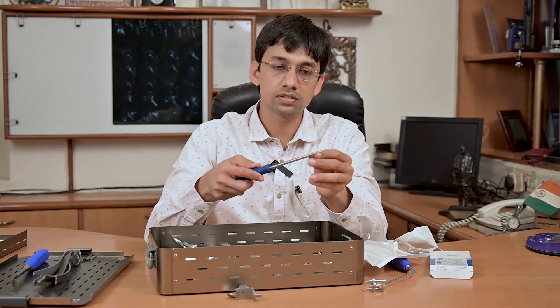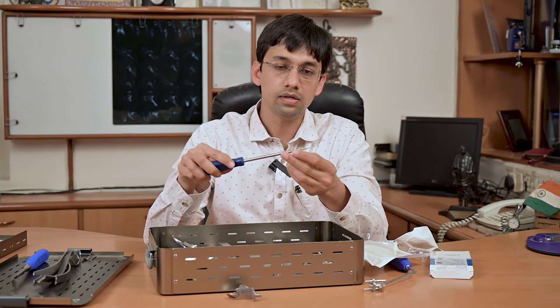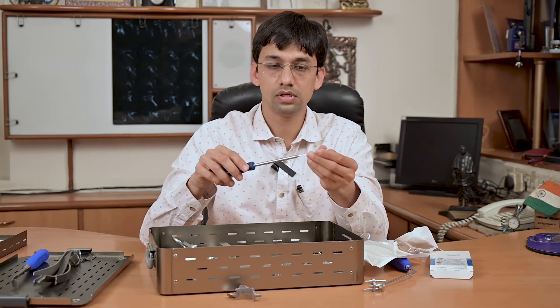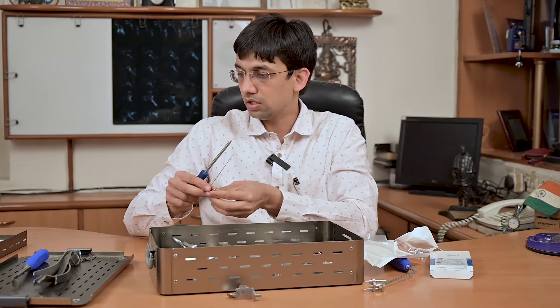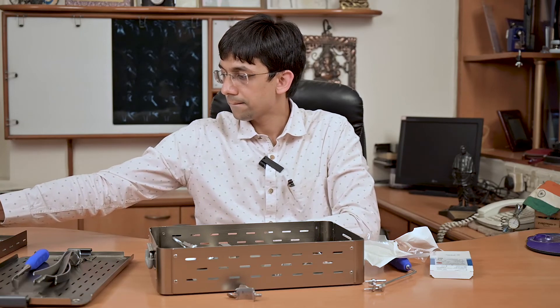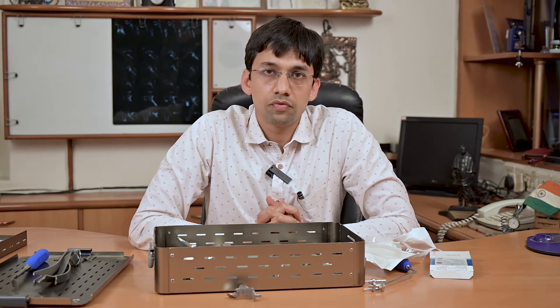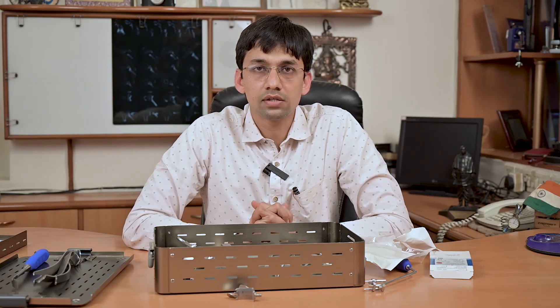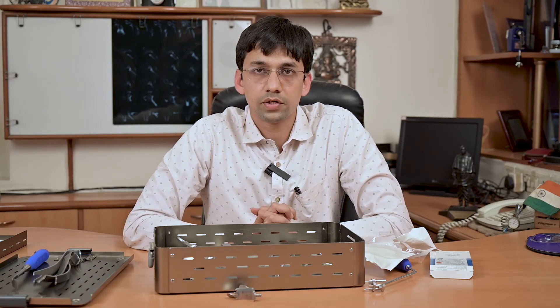The flat under-surface of the screw head helps us achieve the proper compression we desire. That covers all the instruments of the Latarjet surgery by Biotech — the set is known as Bio Latarjet. We hope you understand all these instruments. If you have any doubts, you can write to us in the comment section. Thank you.